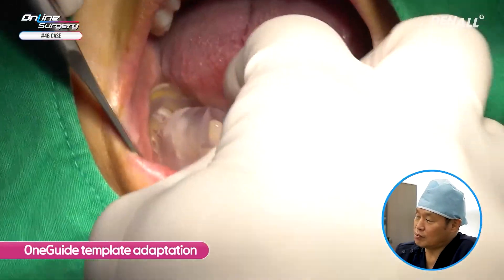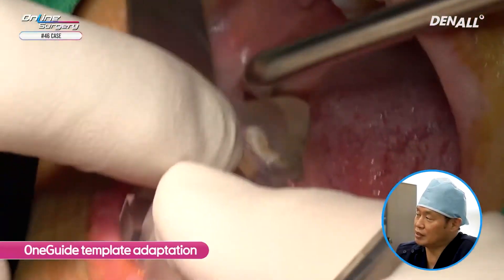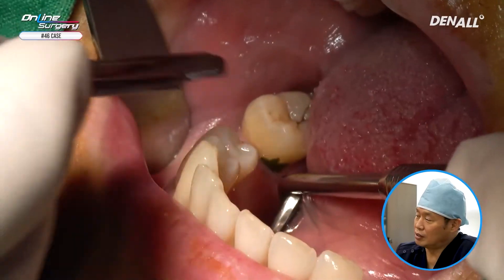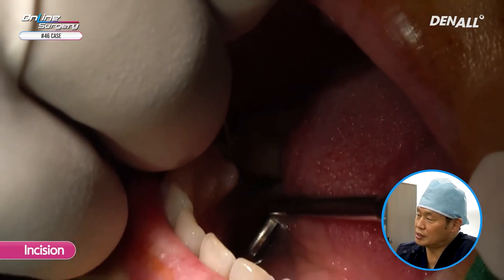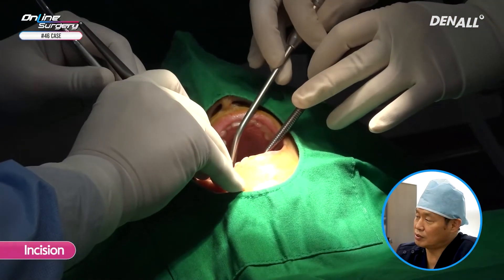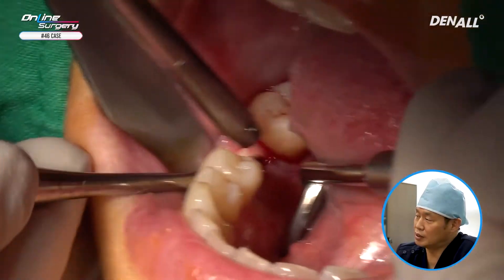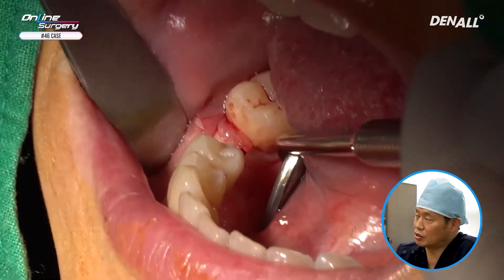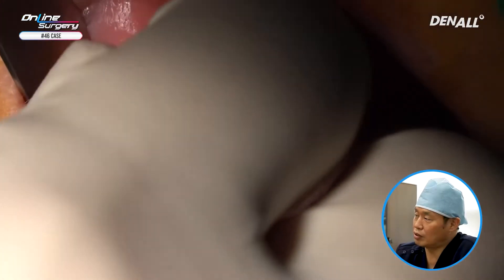First, check whether the one guide template fits correctly. This has been checked. Although this is a single case, I'm going to place an SS implant. The flap is going to be slightly reflected for implant placement, and the space for drilling is checked.